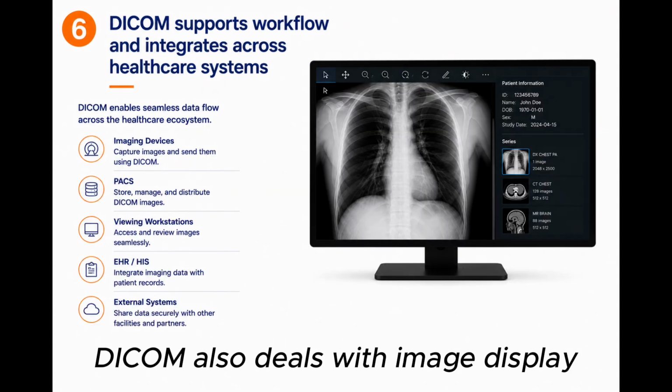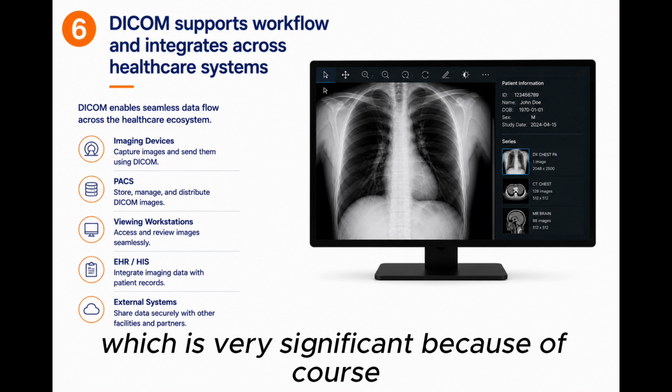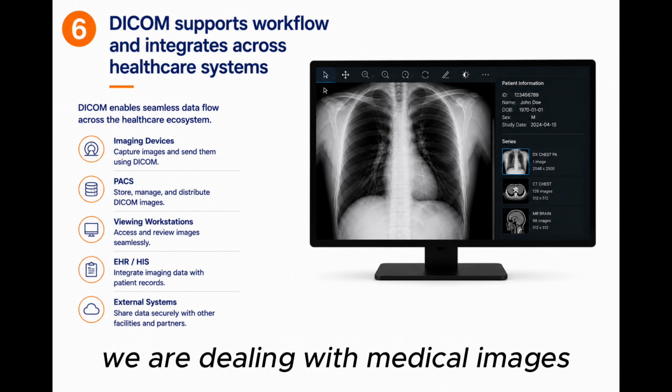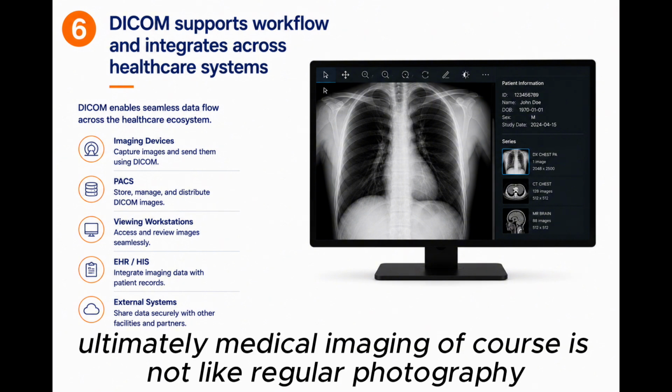DICOM also deals with image display. DICOM even includes standards for how images should be displayed, which is very significant because, of course, we are dealing with medical images and we want to present them in a standardized way. Ultimately, medical imaging, of course, is not like regular photography.